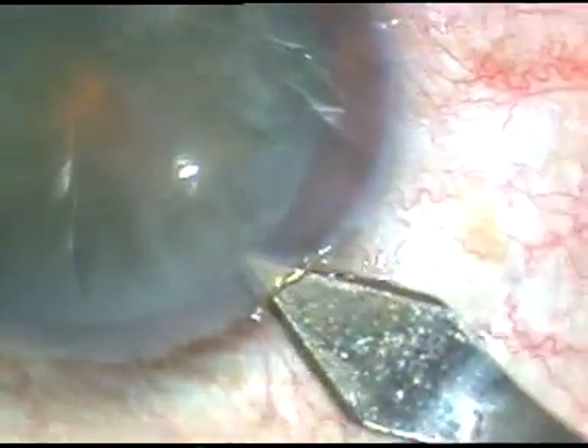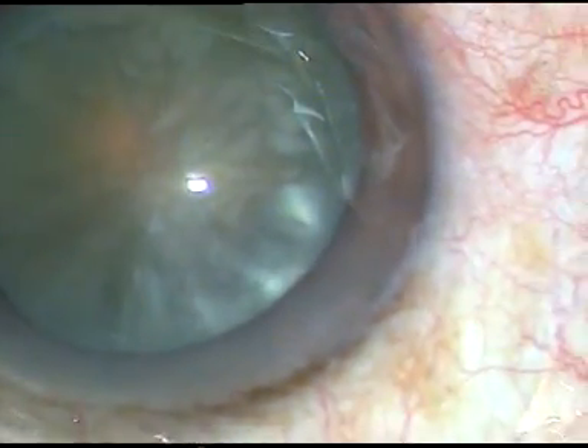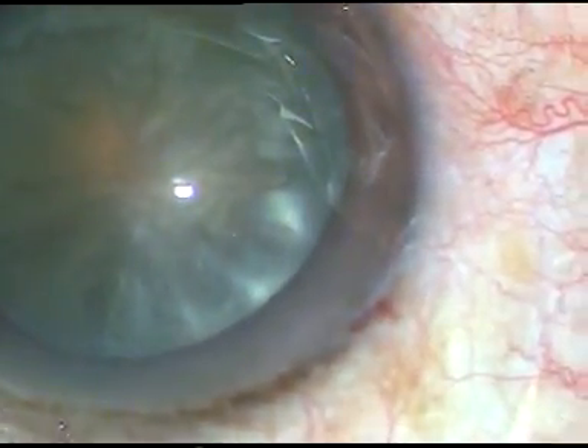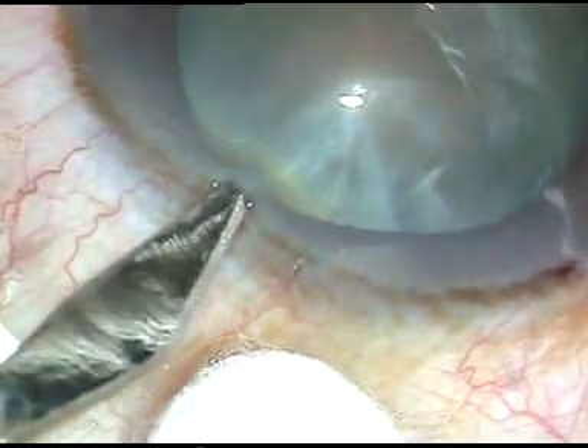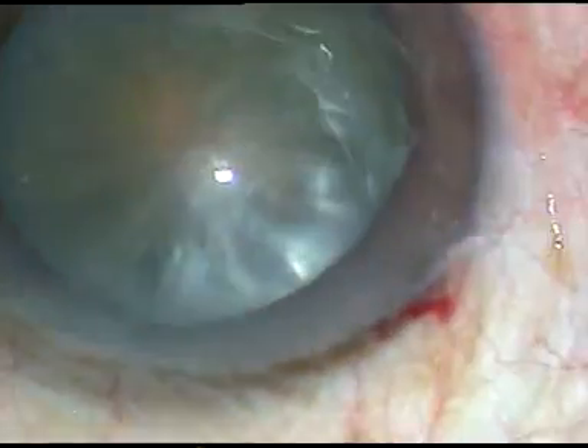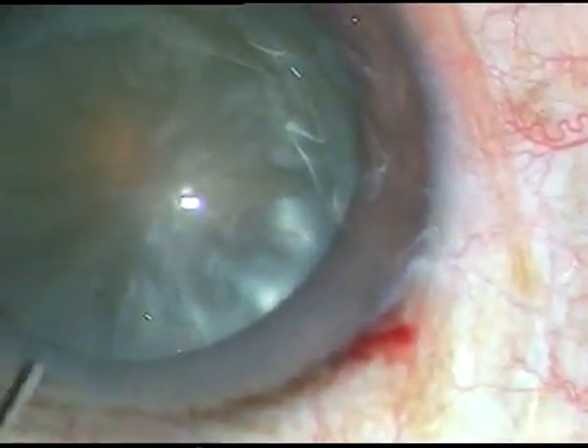This is the main incision — a 2.8 millimeter incision. Now a side port is made on the left side of the main incision. In this case, I am going to manage with only one side port.